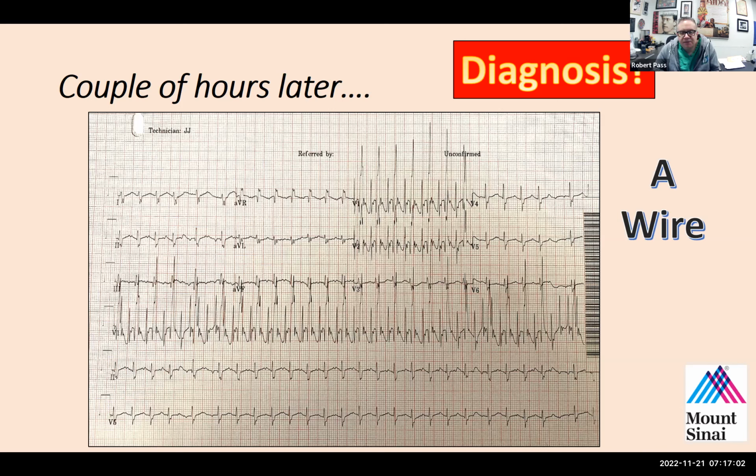How would you imagine it might have happened? If there was something wrong with the atrial wire, for example. And what exactly would be wrong? Lower threshold, higher threshold, bad sensing, oversensing, undersensing?